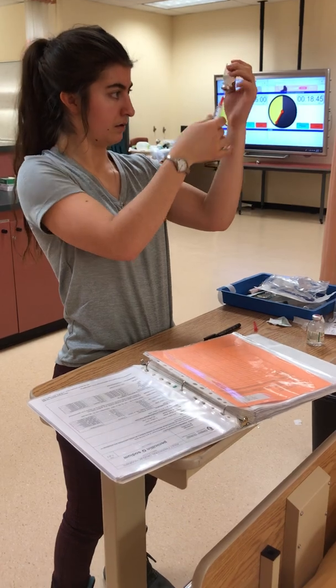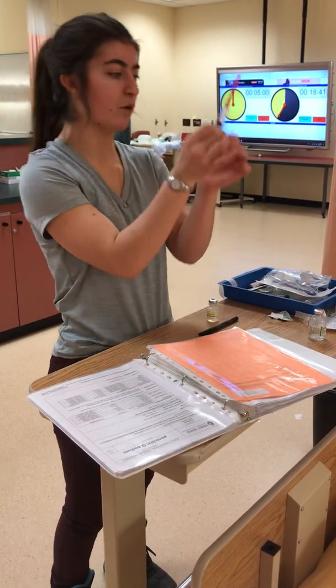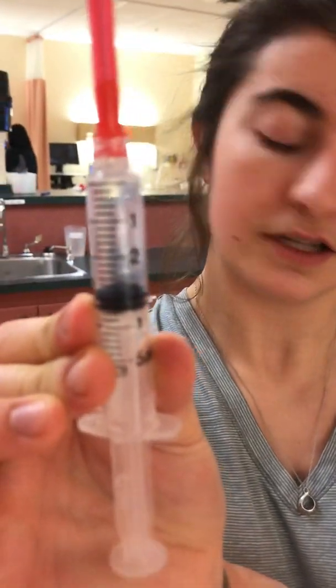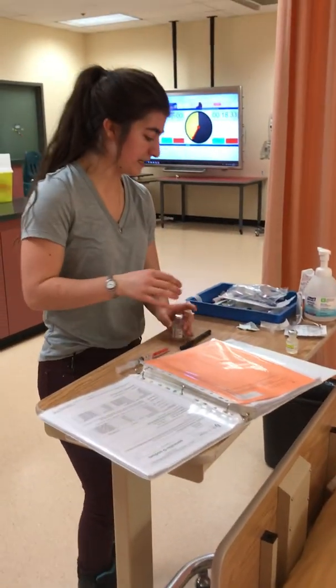Alrighty. So I'm going to scoop that bad boy up. And let's see, we have 3.1 mils in the syringe. Alright, so I'm going to put this away for my second check. And now I'm going to take my penicillin G.